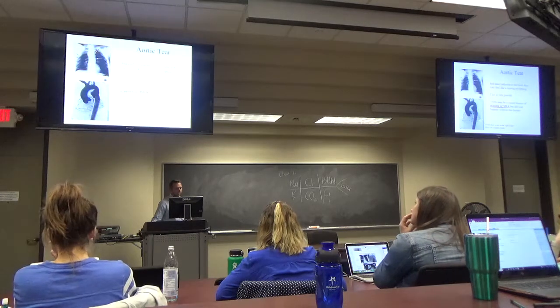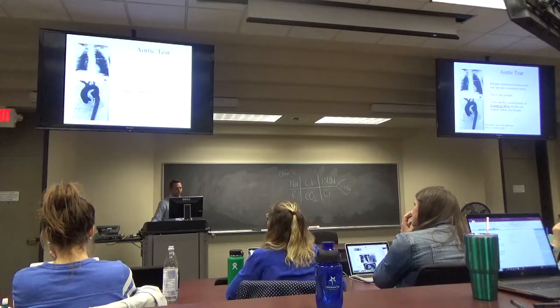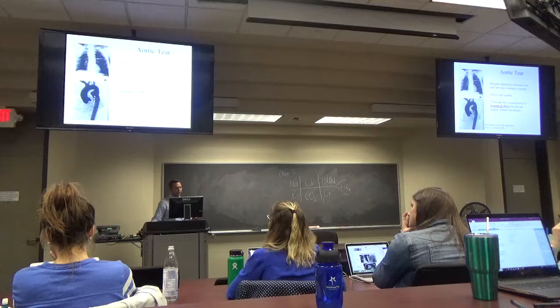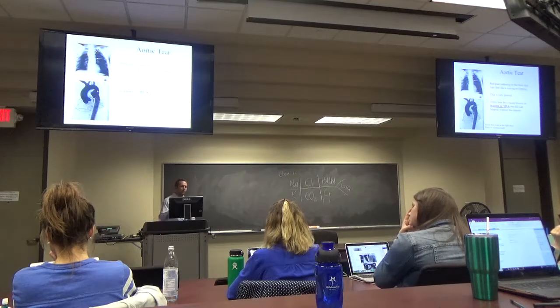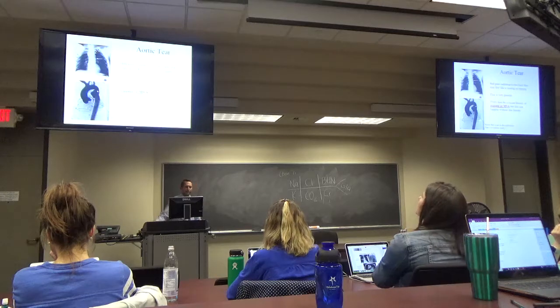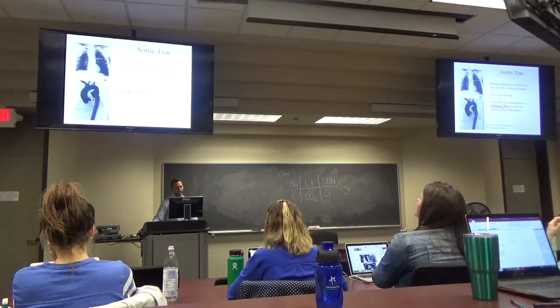You see this? This is the background color. It's supposed to be white. It looks like there is some leaking, but they probably had a patch repair already. They're basically shooting dye into the aorta, and see how this is kind of gray compared to this white. It's definitely leaking out somewhere.